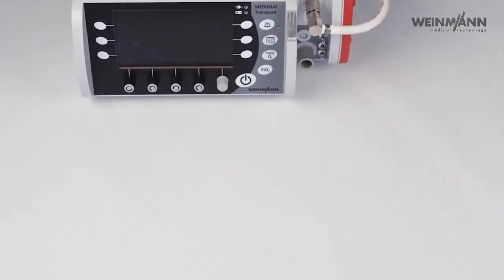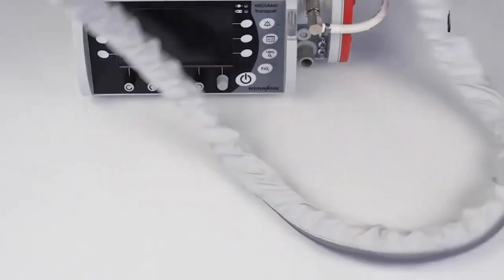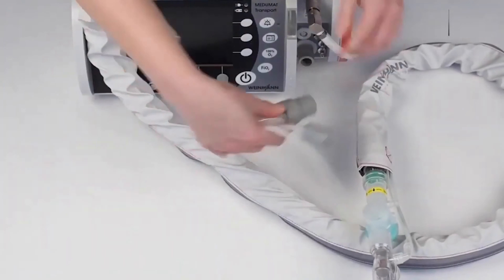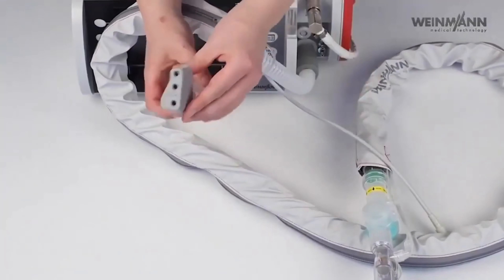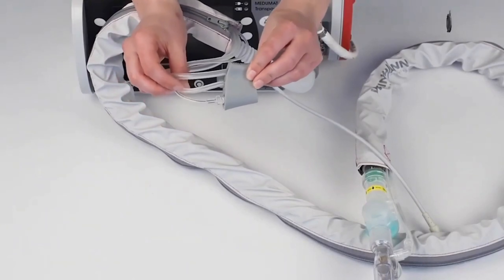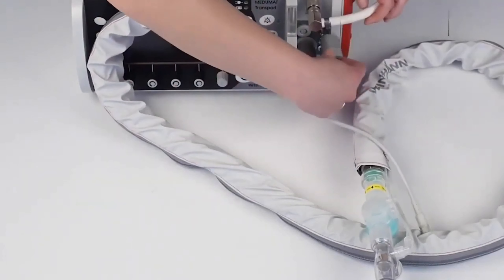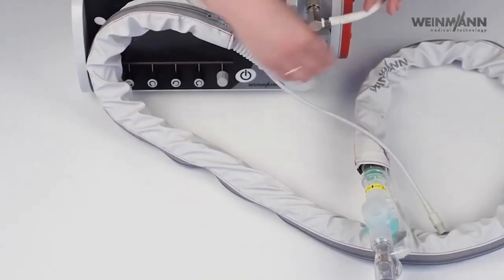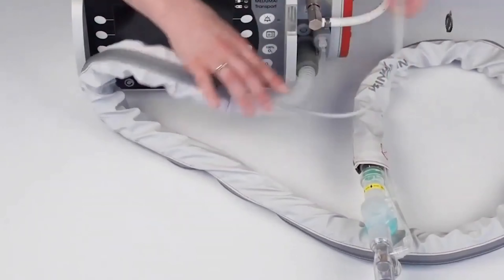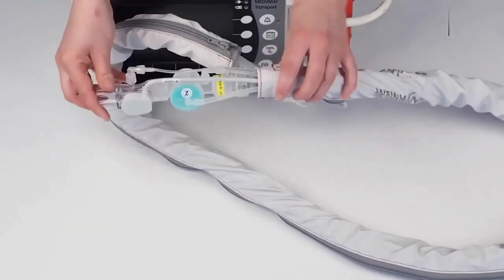After we have connected the gas supply, we connect the patient circuit. The device works with a single-limb patient hose system. This is the ventilation hose — connected here. Then the so-called measurement hose system: we have three hoses — the end-tidal CO2 measurement, the patient pressure measurement, and the PEEP. Because of the silicone port, you cannot connect these falsely. I then connect the measurement cable for the bi-check flow sensor.